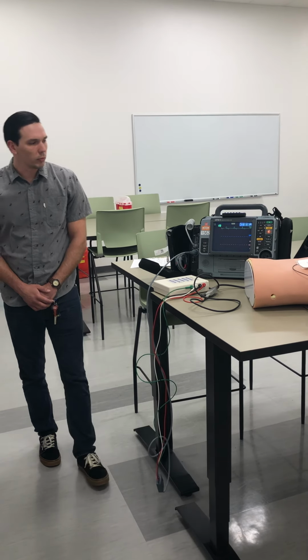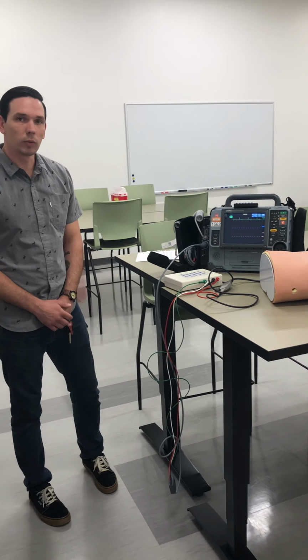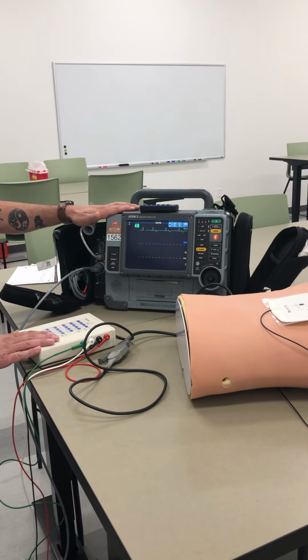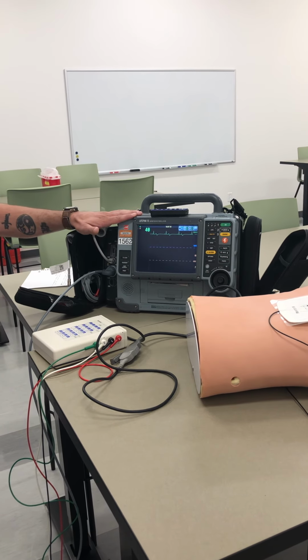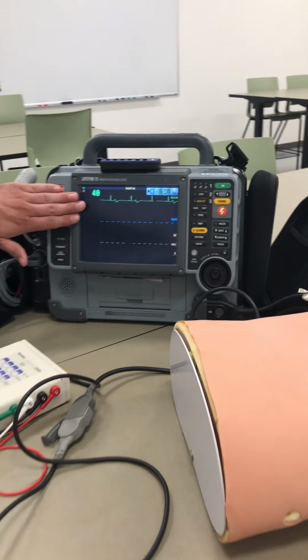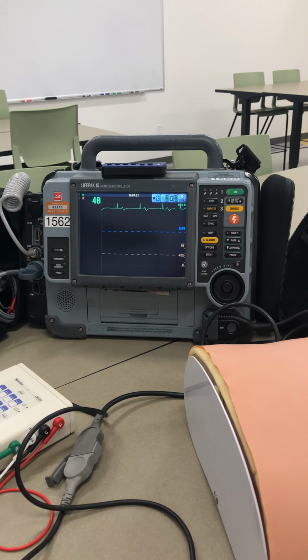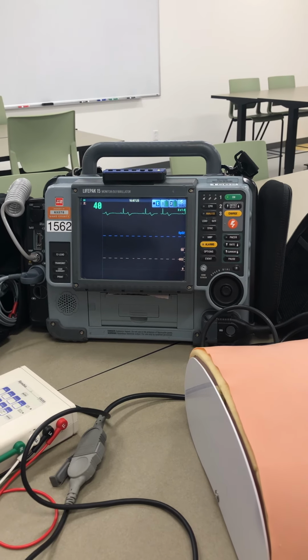We're going to cover real quick the process and procedures of transcutaneous pacing. First thing that you're going to want to do is hook your patient up to the 4-lead on the monitor, which is going to be your right upper, right lower, left upper, and left lower. You're then going to note on the monitor the rhythm that we have. What we have here is a bradycardic rhythm of 40 beats per minute. You're going to note the status of your patient, whether they are unresponsive, have altered mental status, or any other signs and symptoms along with a symptomatic bradycardic patient.